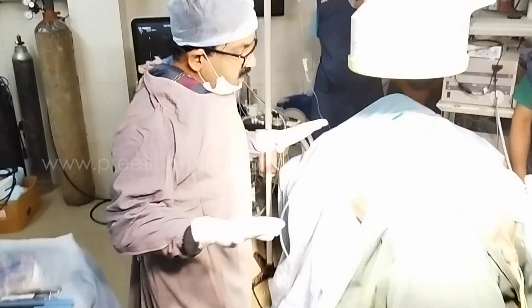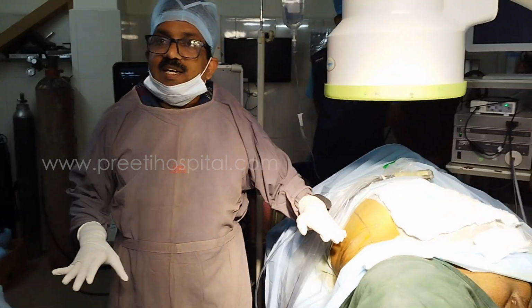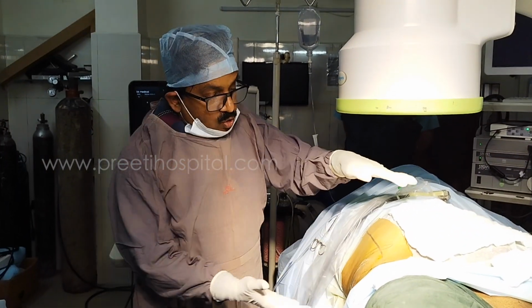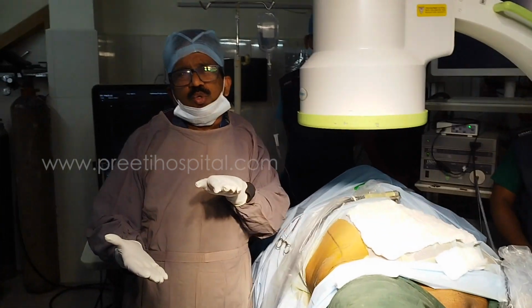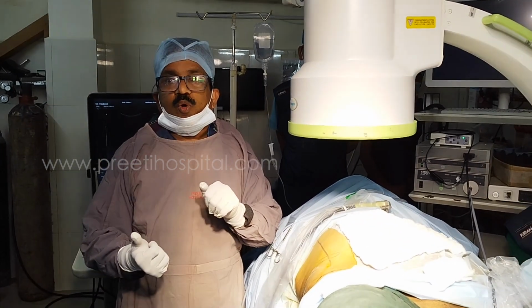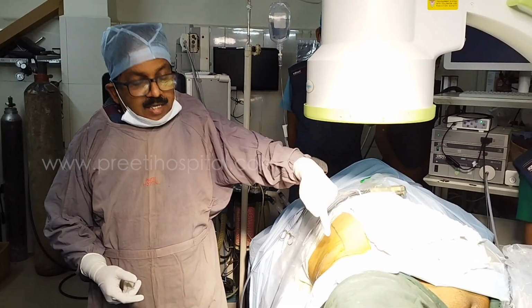Now coming to the thing, in supine PCNL, the puncture will be horizontal. So depth has not much to do with supine when compared to prone. Because in prone, imagine this is a bag, you will go a little down like this.